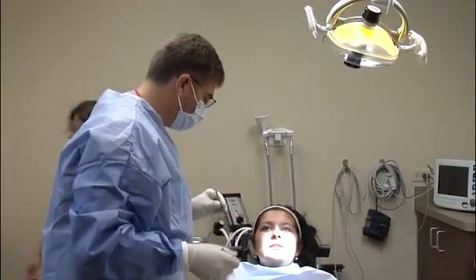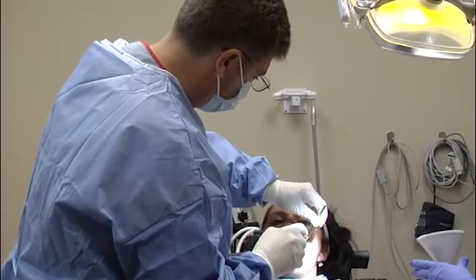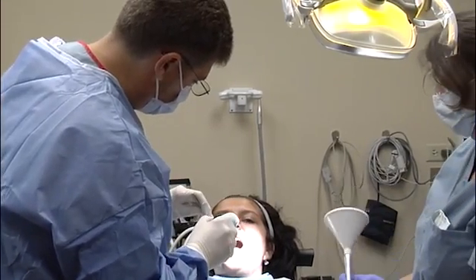The placement of temporary anchorage devices is another excellent example of how orthodontists and oral and maxillofacial surgeons often work as a team to provide patients with the best possible treatment results. As they told me what was going to happen and how they were going to do it, I was much more comfortable. The surgery is done in the oral and maxillofacial surgery office using local anesthesia. The TAD is simply screwed into the proper position and the patient can resume their normal activities that day.